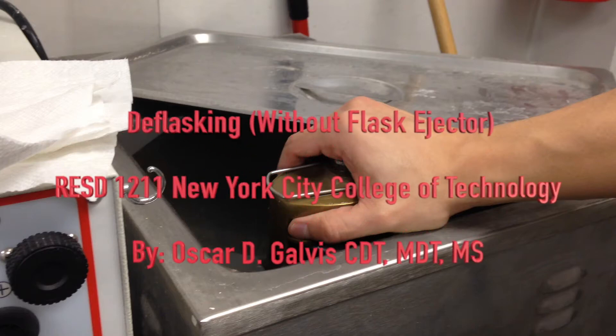Hello and welcome to the instructional video for Deflasking for Complete Dentures 2, for the Department of Restorative Dentistry at New York City College of Technology. My name is Professor Galvis. This video will show instruction on deflasking without the use of a flask ejector.